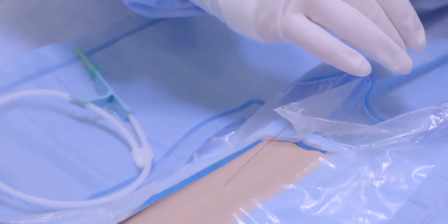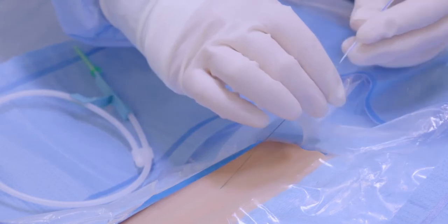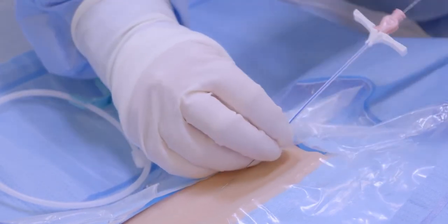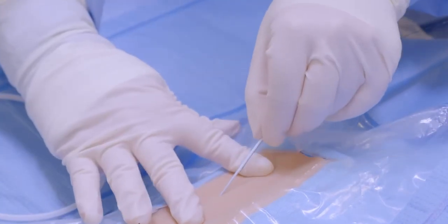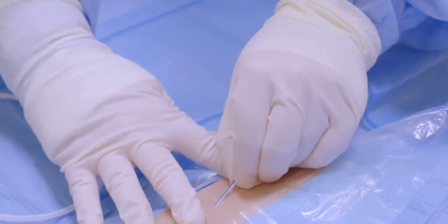Thread peel-away sheath dilator assembly over guide wire. Grasping near skin, advance sheath dilator assembly with slight twisting motion to a depth sufficient to enter vessel. Thread the sheath dilator assembly through the skin and into the vessel.